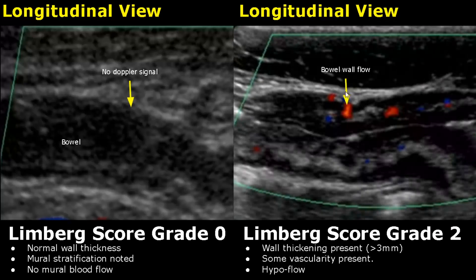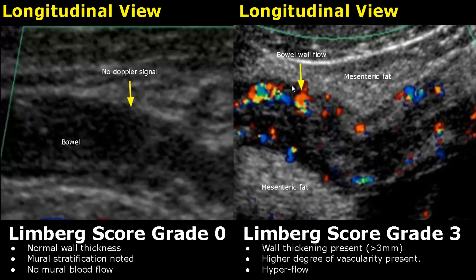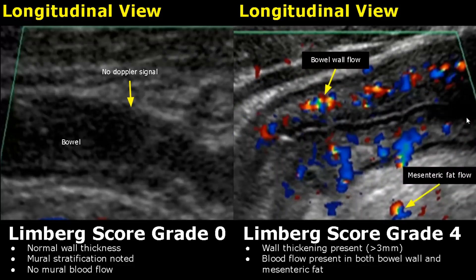Limburg score grade 2 is given when some blood flow is noted within the bowel wall — this is termed hypoflow. A grade 3 Limburg score will have a large amount of vascular flow found on color Doppler — this is termed hyperflow. In a Limburg score grade 4, blood flow within mesenteric fat will be found along with bowel wall hyperemia.